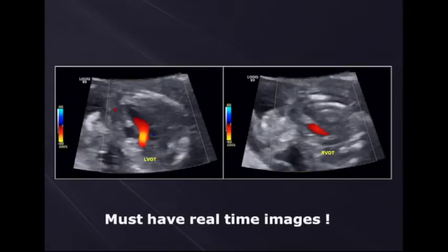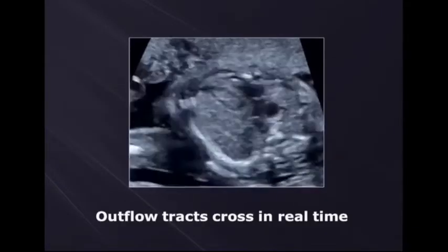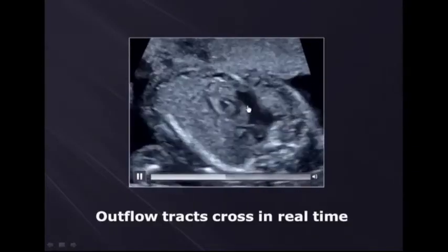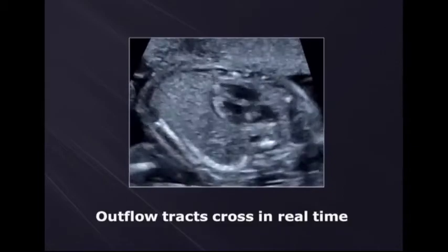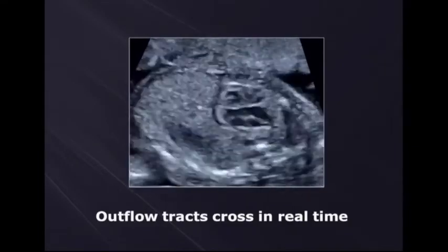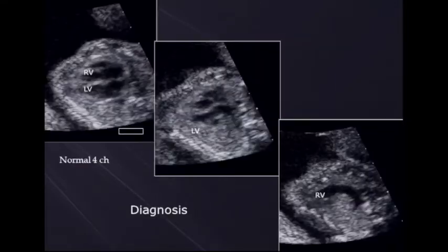Here are very nice outflow tract views, but they're not in real time, and I always emphasize obtaining things in real time. They look like they crisscross here, but it's nice to have real time. So again, you want to see the RVOT, and then you want to see the LVOT, RVOT coming straight down, LVOT coming more parallel to the long axis here. This is a case of a normal, but in real time. You've got to see the RVOT, LVOT in real time.